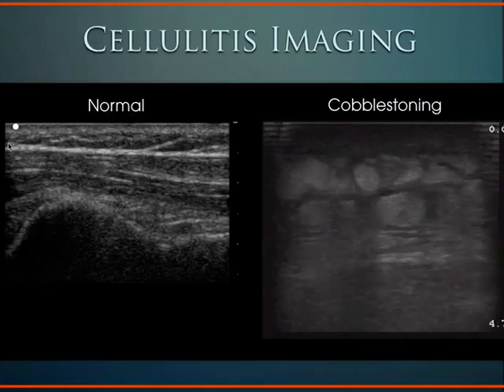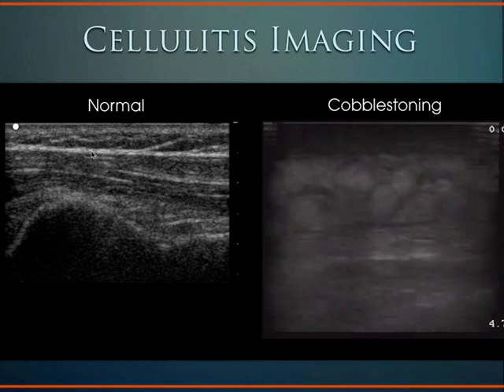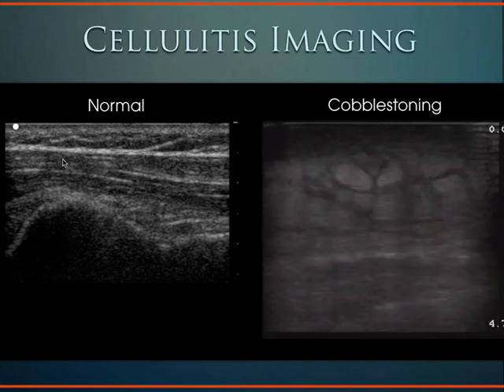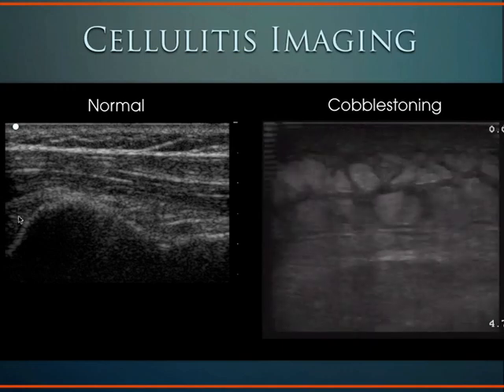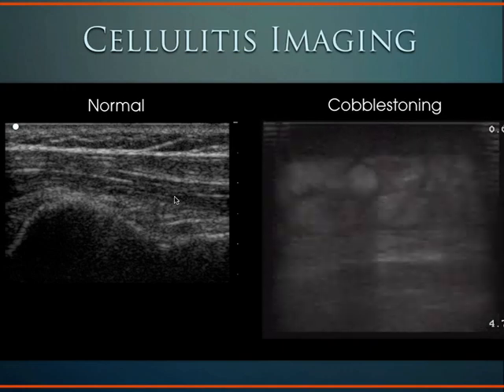So normal soft tissue kind of looks like this. We see skin line here, subcutaneous fat, and this is a fascial plane seen here, and some more soft tissue, and here's some bony structure here. This looks like a tendon coming across here.